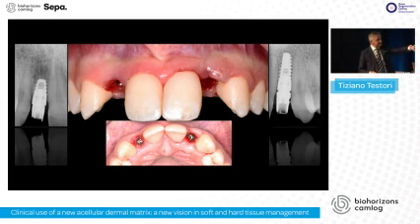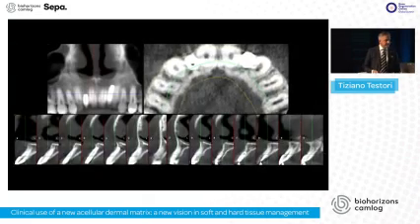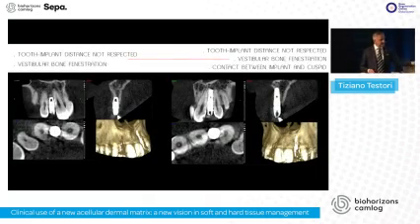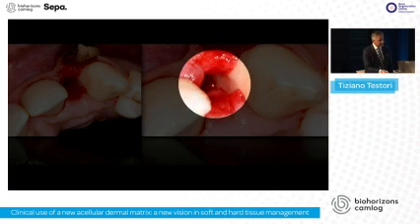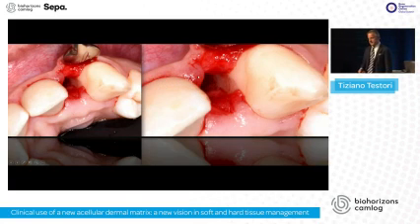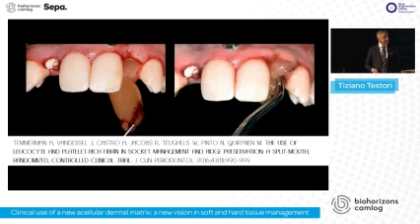A disaster because the implant touches the natural tooth of the patient. As you can see here, we unscrew the implants, and as you can see, you have the threads of the implant on the poor cuspid of the patient, a young patient.